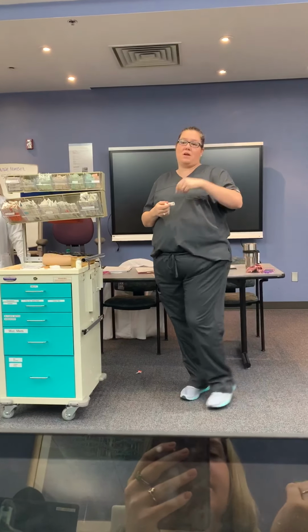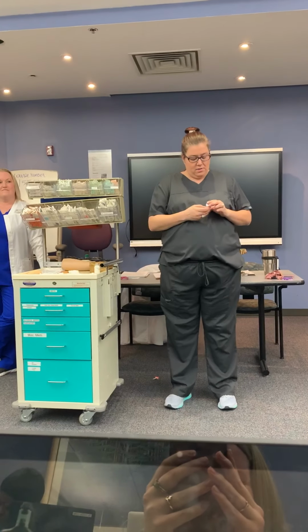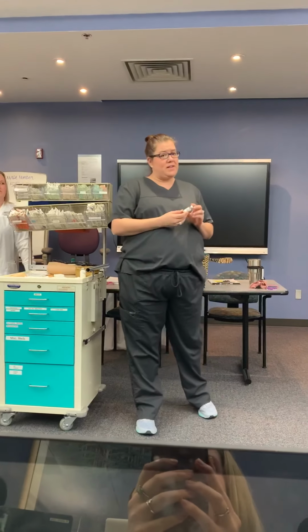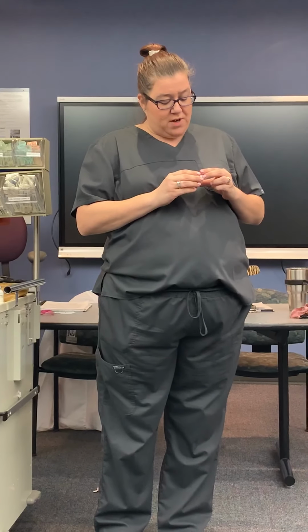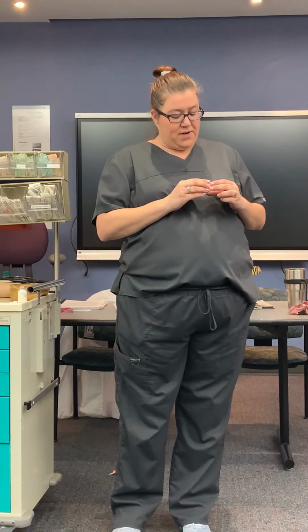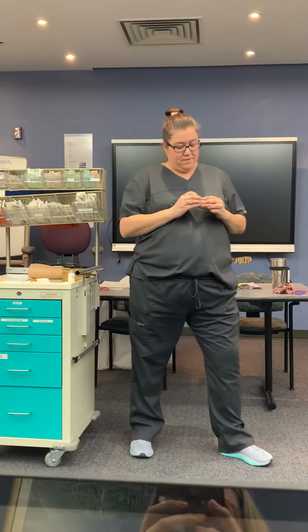What are we giving it to our patient for? Pneumonia. For respiratory pneumonia. Okay. So on here, when you go to the vial, it's very small, so pardon me. Concentration and prepared solution, amount of diluent to be added, and then the reconstituted solution volume.